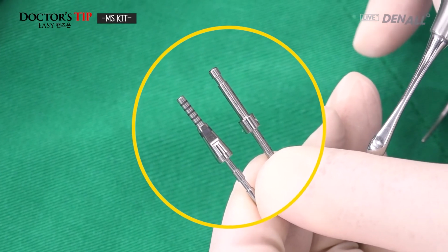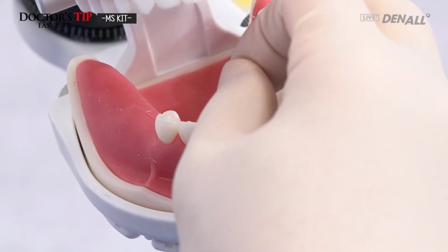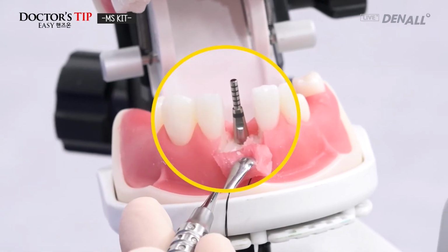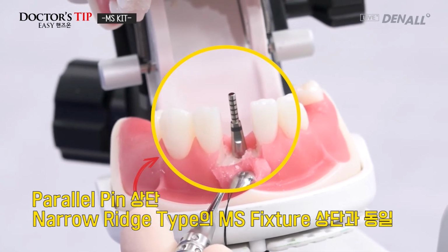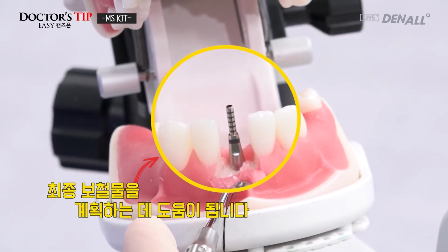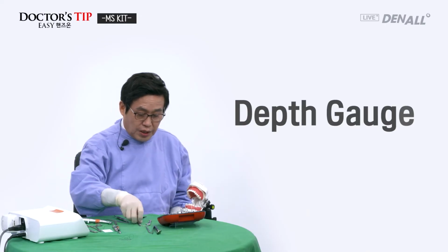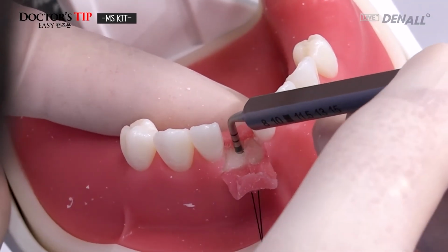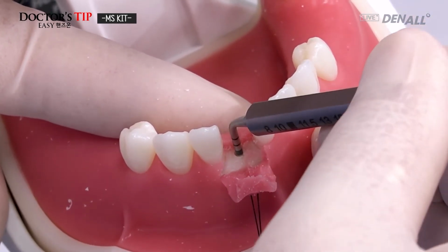Checking the final prosthesis is helpful because the guide pin looks the same as the implant. So you push in the guide pin, and like this, the upper part is the narrow ridge type MS fixture. The design is the same as I told you, so it's helpful in planning your final prosthesis. So it's a better guide pin for doing that. Again, I'll check the depth with the depth gauge. And as you can see, it's sufficient, drilled up to 11.5 millimeters.